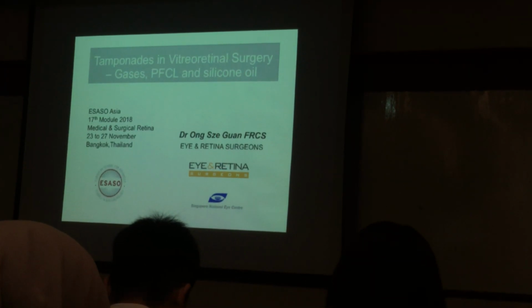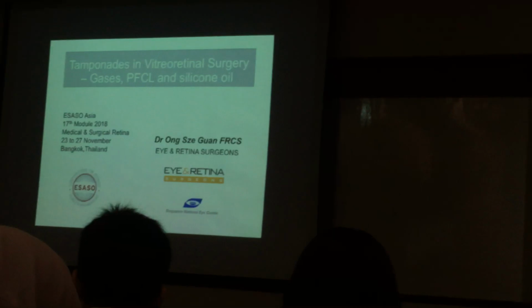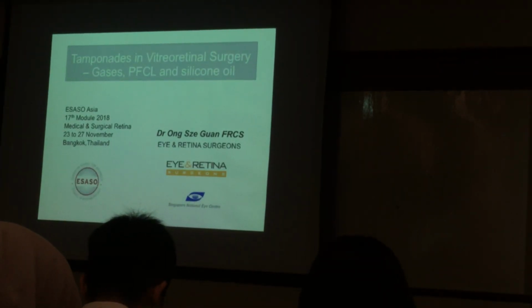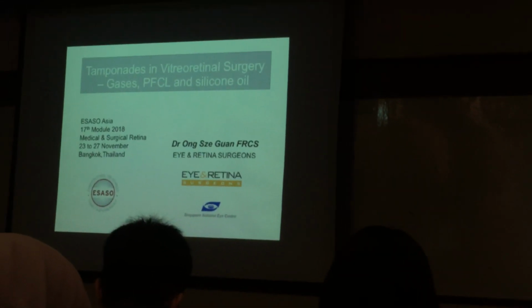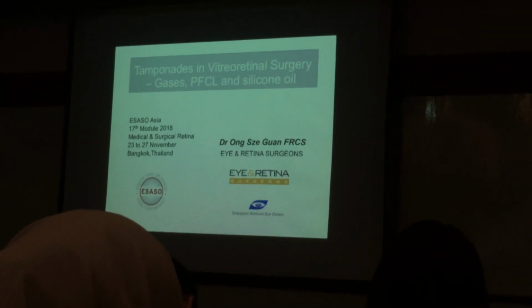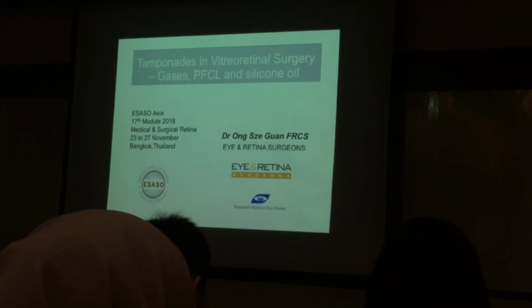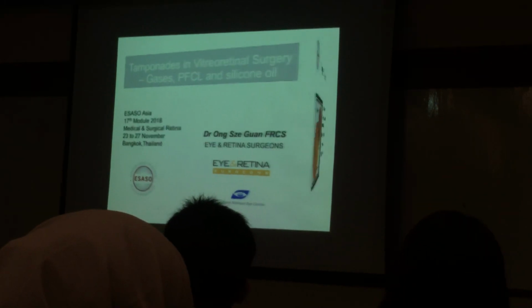And the tamponades that we're talking about are mainly the gases, both air as well as the long-acting gases, fluorocarbon liquids, as the synonym for PFCL, and of course one of our frequently used tamponades, silicone oil.